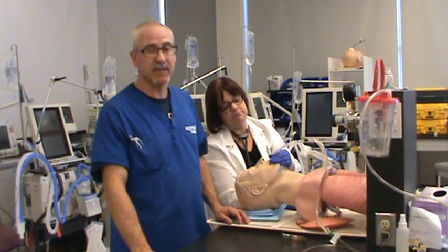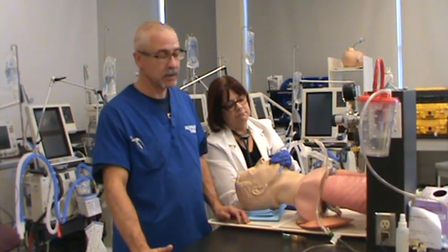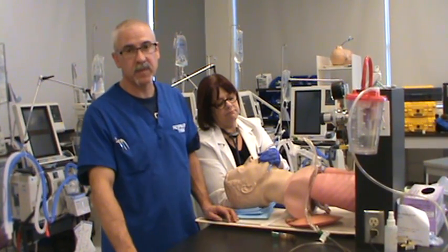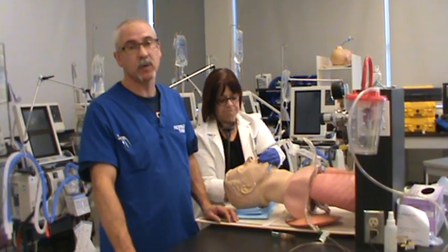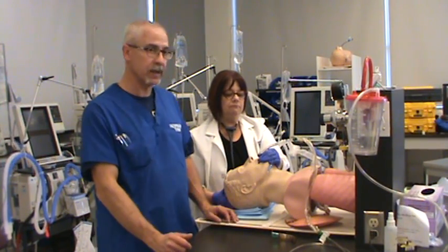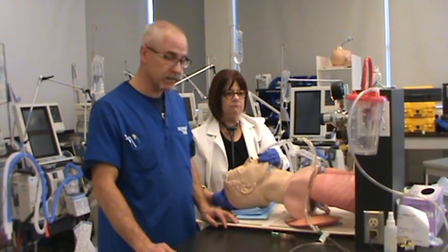Which side do you put the tube on? Well, it doesn't matter, just as long as there's no sores or lacerations on the side you've chosen. This patient has no problems with their mouth, no lacerations, and no reason why we couldn't use the right or left side. So we're going to start on the patient's right because it's more convenient for this video.